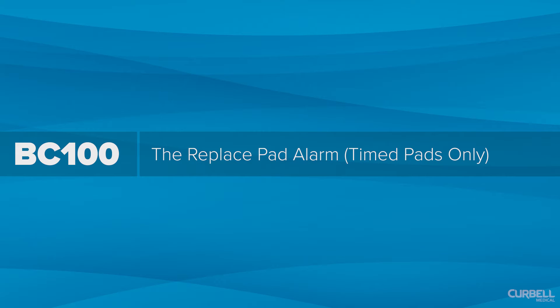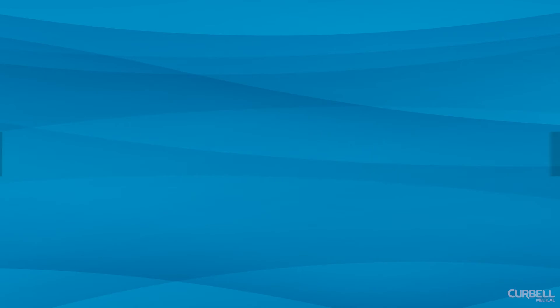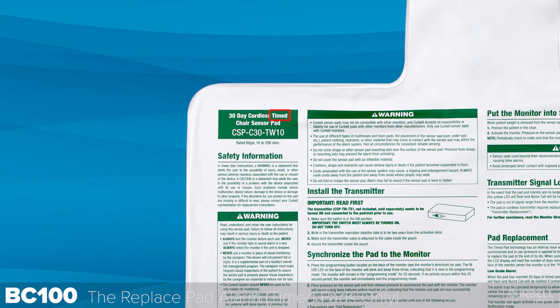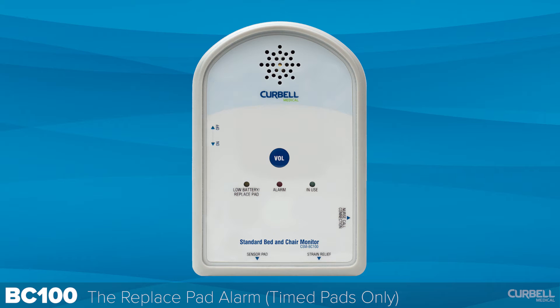The replace pad alarm. Timed pads have an internal clock that will count down the life of the pad only when the pad is connected or synchronized to the monitor and pressure is applied to the pad. The monitor will automatically activate an alarm notification to replace the pad at the end of its life. The monitor alarm may be temporarily canceled by turning the on/off switch off then on again to allow time for continued use until the pad is replaced.